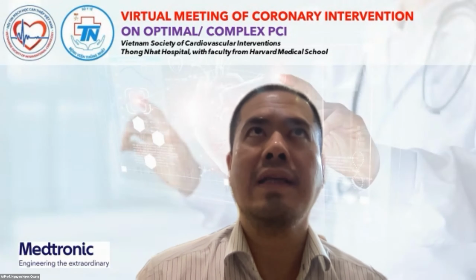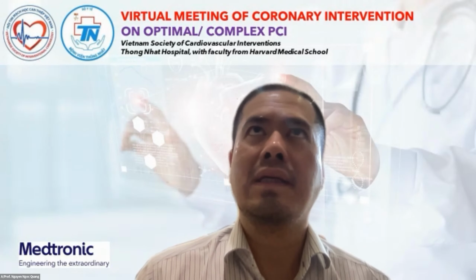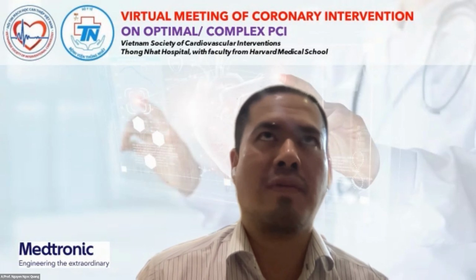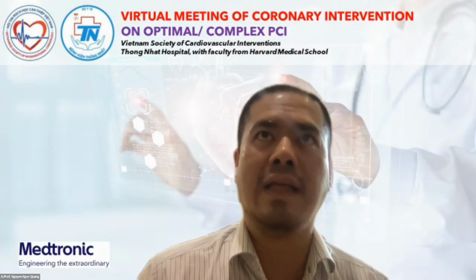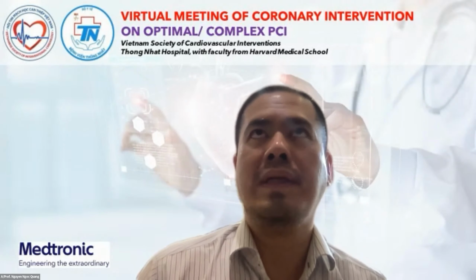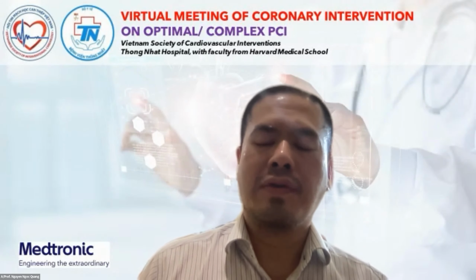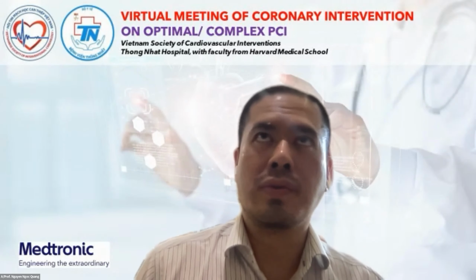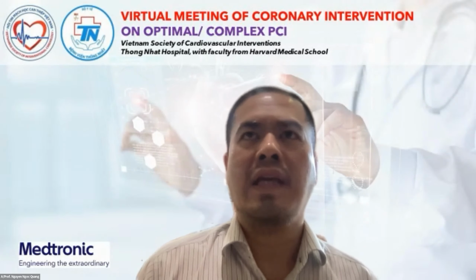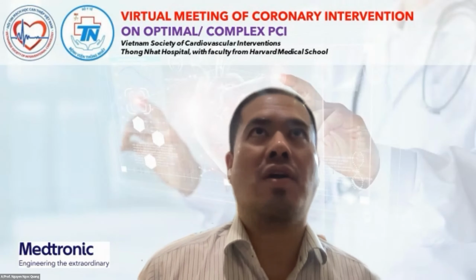If we recommend too much, people may think that it is not useful, but actually if we put it early, then we can save about 10 to 15% of patients who would become late cardiogenic shock. So in my own opinion, for a young patient at risk of becoming cardiogenic shock, we should do something for them, and IABP is a good choice because you don't have anything else. If you put it late, it doesn't work. So just do it in the early phase or don't do it.